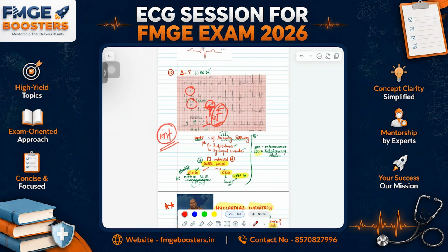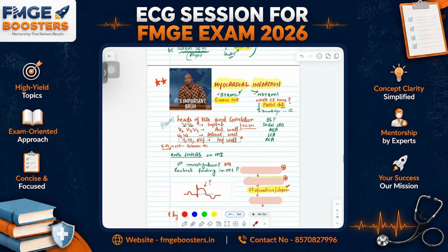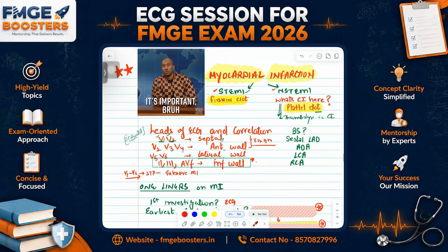Inferior leads: 2, 3 and AVF. Clear, everyone? I hope this is pretty clear with you. Now let's talk about the ECG blood supply. V1, V2 is septal, which will be septal LAD. V2, V3, V4 is the anterior wall, which is LAD, and V5, V6 will be LCX, and 2, 3 and AVF, the inferior wall, will be the right side.